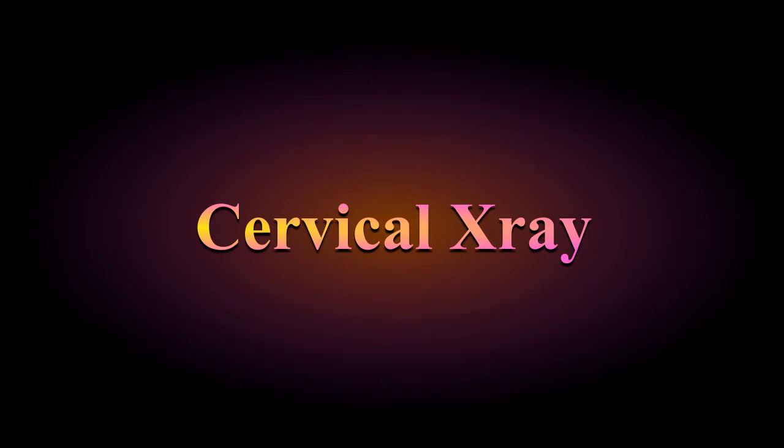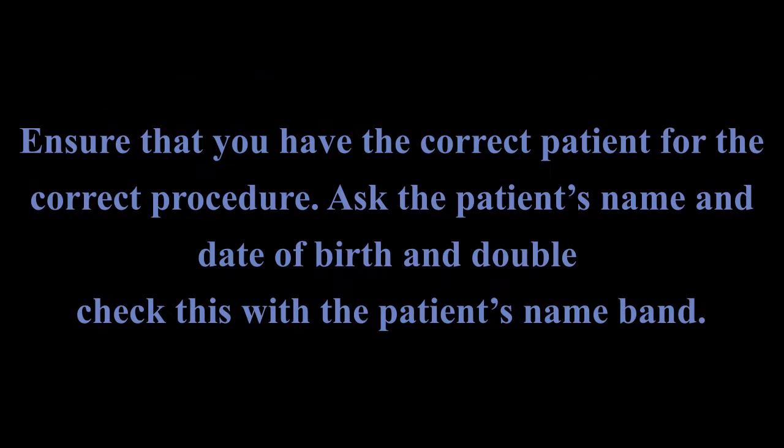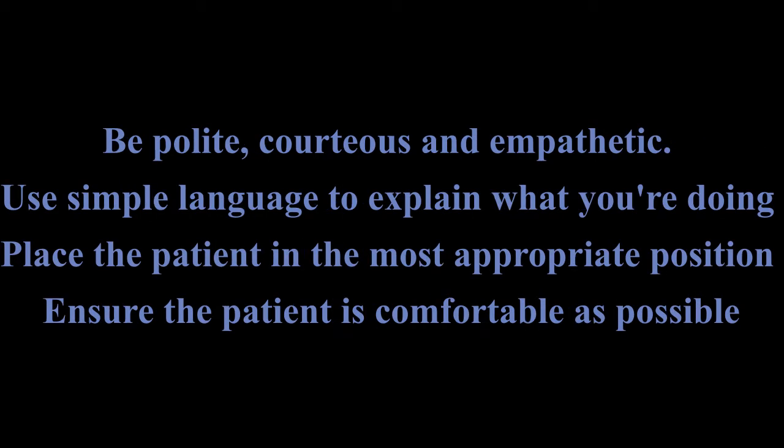Good morning, guys. My topic is about cervical vertebrae. Before going on with the procedure, make sure that the person called is the right patient and with the right procedure.